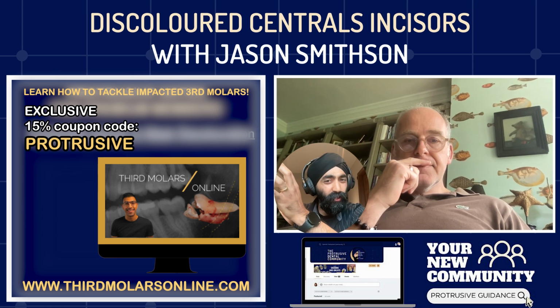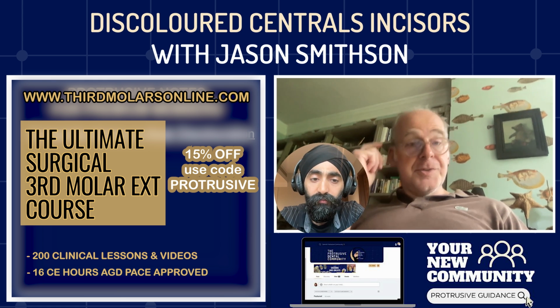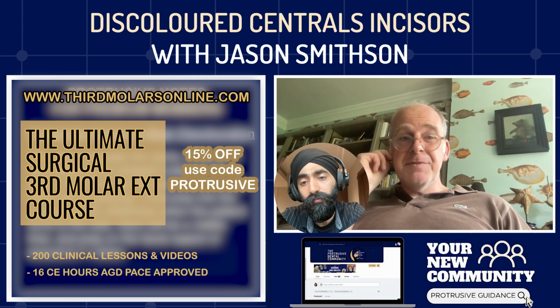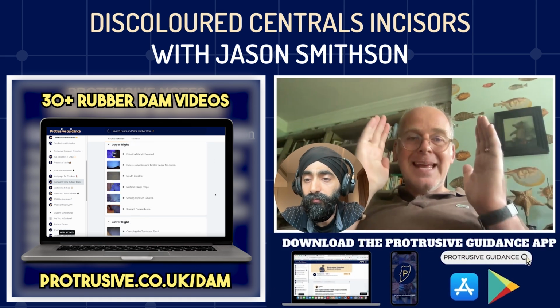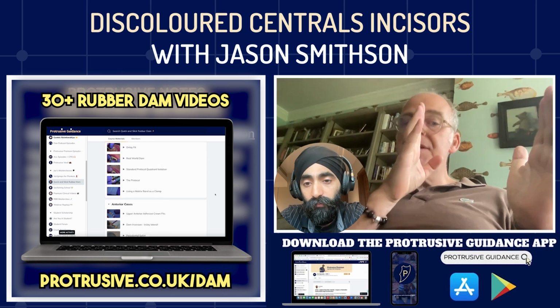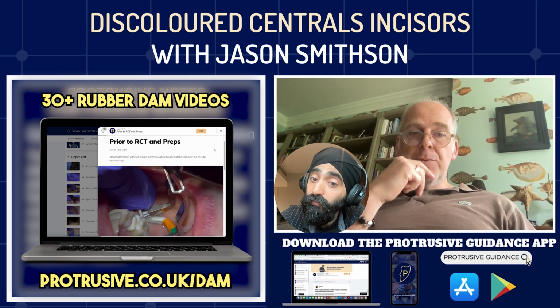How does the prep of the direct composite veneer differ from the prep that you're sending to your technician for a ceramic veneer? It's broadly the same. So you need to prep subgingival. You need to prep somewhere between 0.3 and sometimes even 0.5 if you've got the room into the sulcus. Otherwise you get grey. You've got to prep into the contact points. Otherwise, when the patient turns to the side, you can see a line. And you've got to prep some off the facial, perhaps again 0.7 to 1 millimeter.